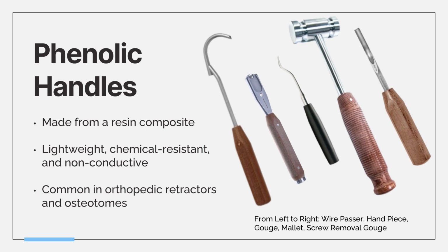They have better grip and comfort for surgeons due to their textured surfaces for the most part. So the textured surfaces actually prevent slipping and reduce hand fatigue. So phenolic handles are basically very low maintenance. They retain appearance and integrity for a very long time. And if you look here, I provided some examples.